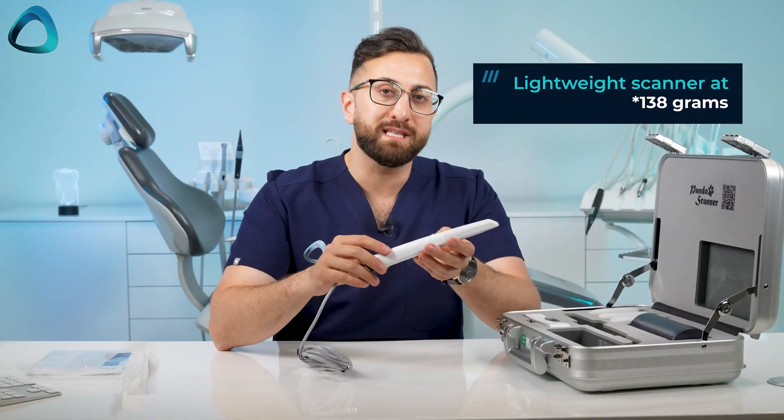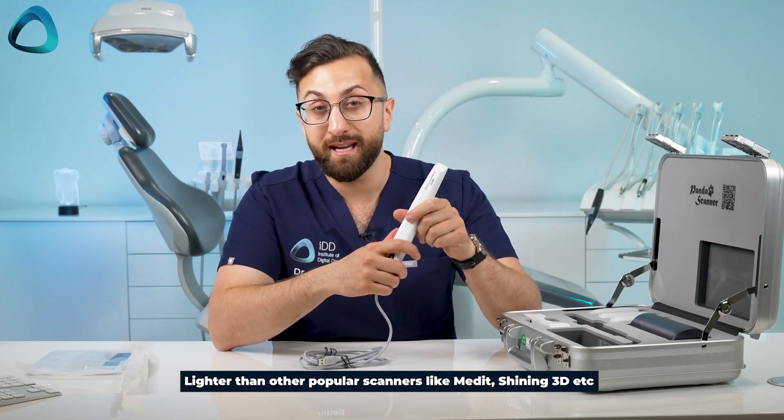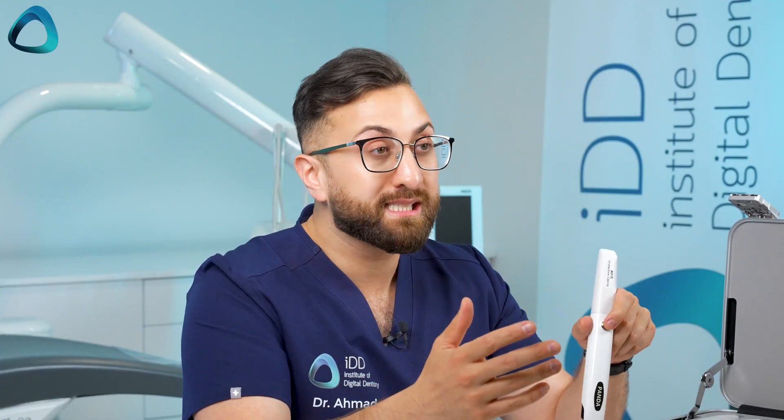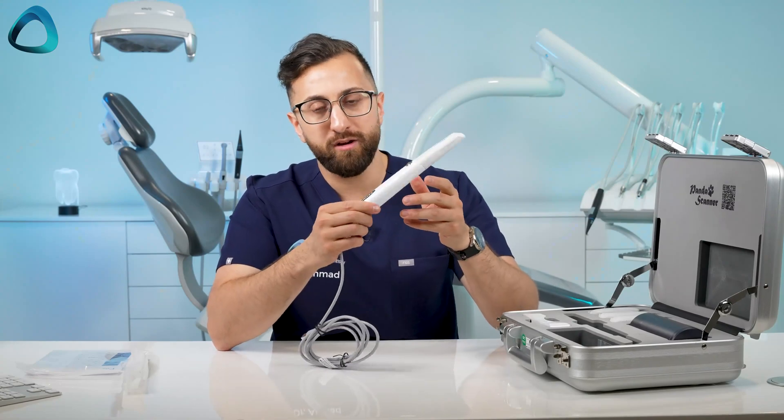At 137 grams, this makes this scanner one of the lightest scanners on the market and definitely the lightest latest-generation scanner. I reviewed a long time ago the WOW scanner, which was around 110 grams, so this is not that far off — quite incredible.